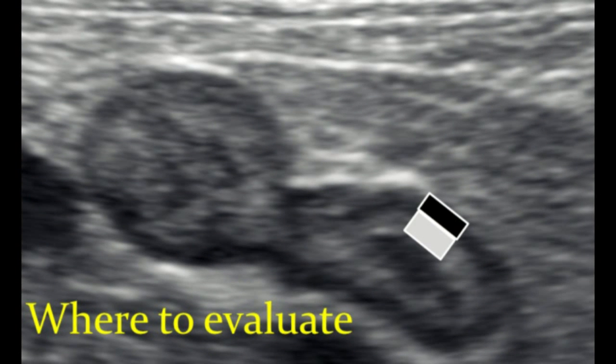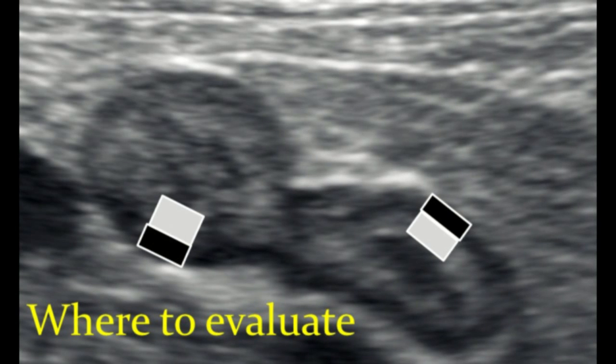Now, yes, here you would be using a ruler to make comparisons, but you can almost do it visually with your eye at the same time. So the same thing at the other pole of the adrenal gland in this case. And I think it's important that you do it in a few places in order to acquire a pretty representative measurement.